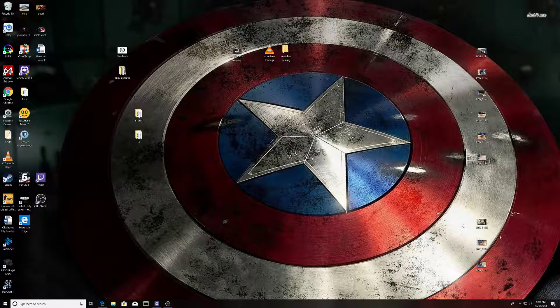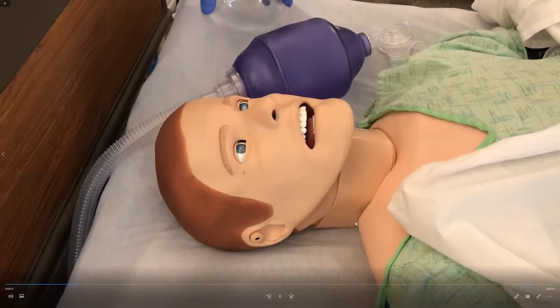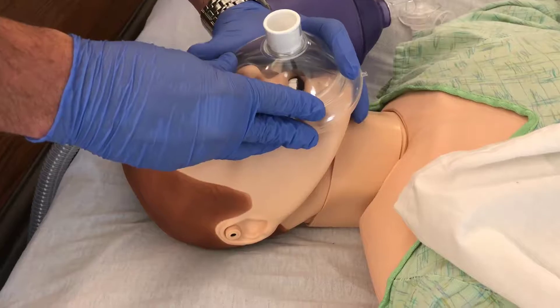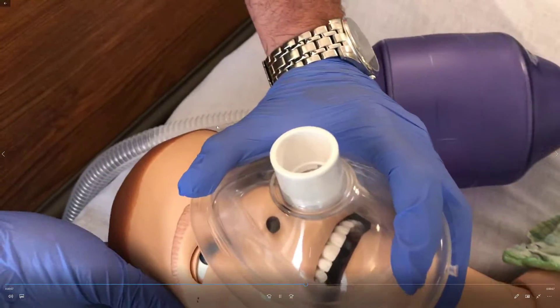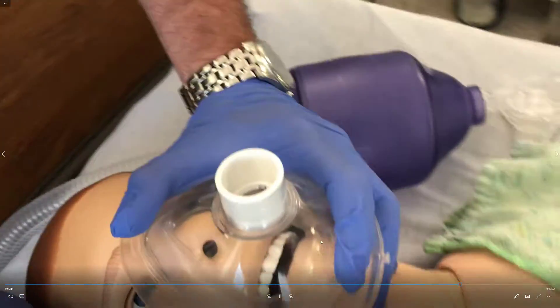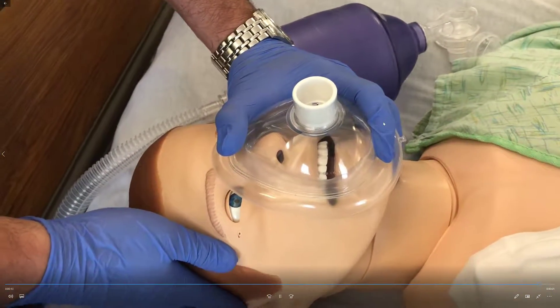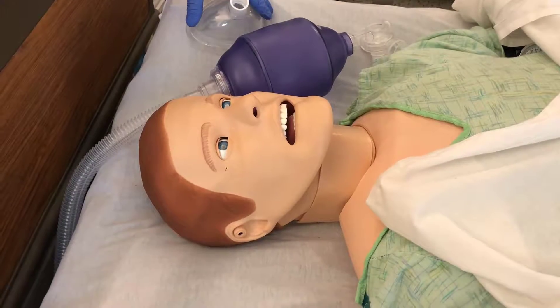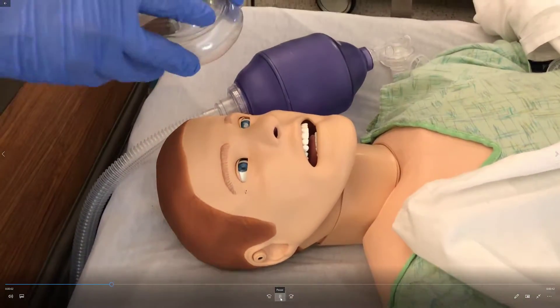Now I'm going to show you how to put the mask on and get the proper seal. You're going to do the EC clamp: the top part of the mask will look like your hand is forming a C, and down here your hand will look like it's forming an E. I know it looks backwards in this video — we're just doing it on this side for demonstration purposes — but you can clearly see the C, and his other three fingers make the shape of an E.